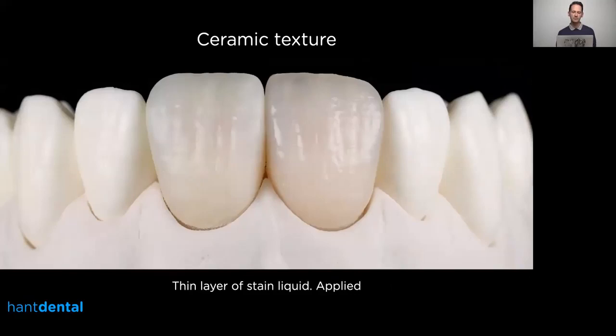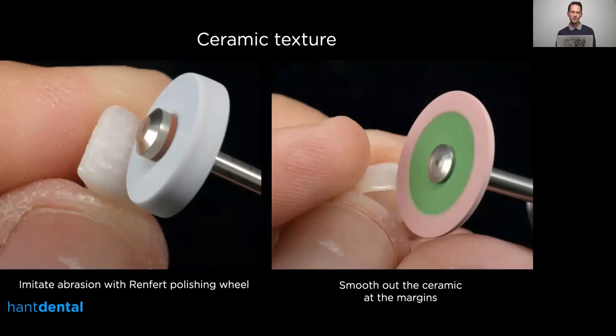Here's the result after texturing. I applied a really thin layer of stain liquid so you can see the reflections better and judge your texture more easily. I highly recommend using a really thin layer of stain liquid, because if you put too much liquid on the surface it fills up all the details and makes it much harder to see. With just a thin layer you can add extra modification or start to polish.